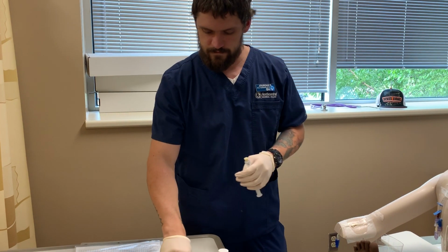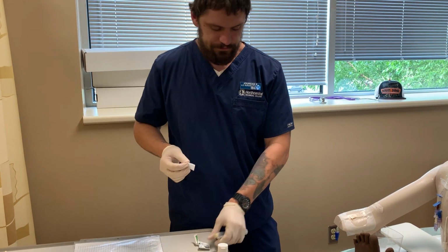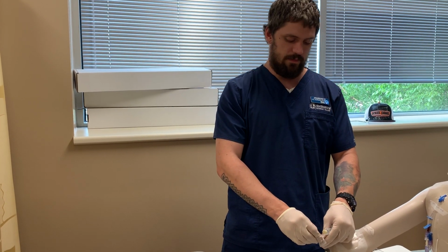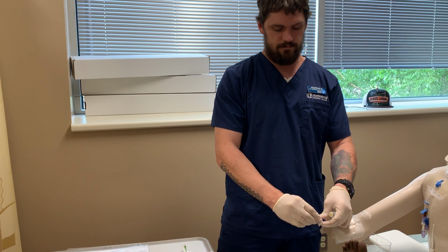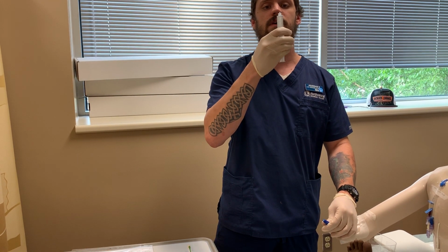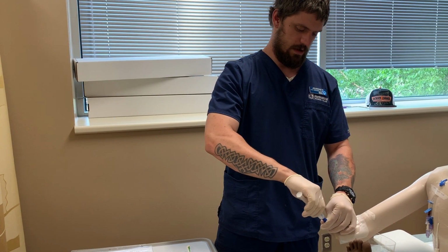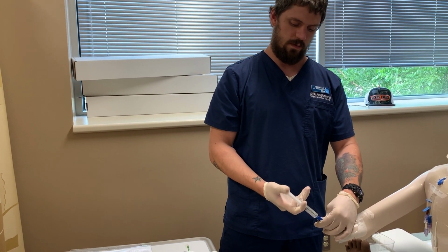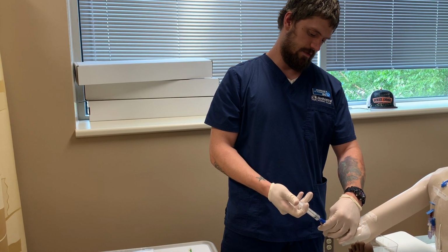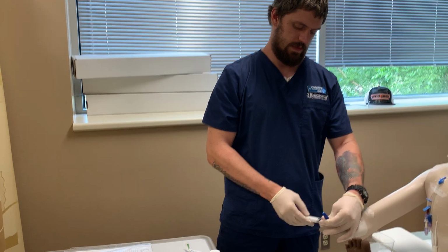All right, you ready, Miss Doe? I am. Awesome. Get rid of that pain for you, huh? All right. So I'm going to start by, if there was a cap on here, we would take the alcohol impregnated cap off and wipe for 20 to 30 seconds with our alcohol pad, allowing that to air dry. We would again make sure that the air is out. Connecting. And because this is a PICC line, we would be using a pulsating flush to do our first flush. Okay, clamping it, removing, and this can go in the garbage.